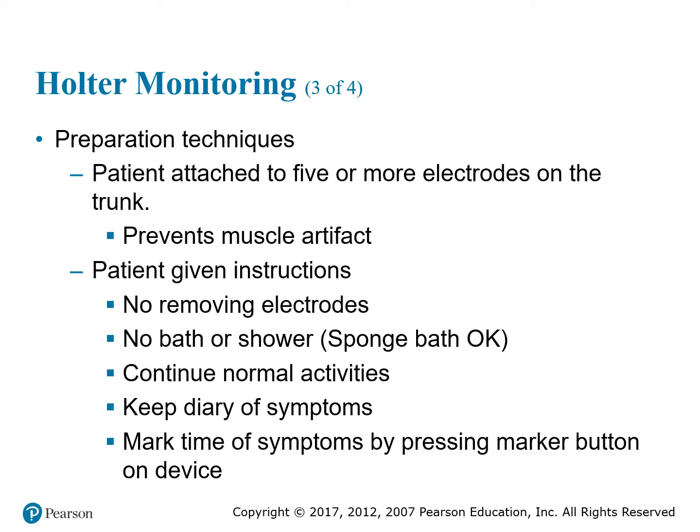Preparation techniques for a patient to prepare for a Holter monitor. Patients must be prepared for the Holter monitoring procedure both emotionally and physically. There's just something about putting a device on a patient to monitor your heart. They sometimes have anxiety. It's our job, as we're placing the monitor or educating the patient as to why we're placing it and what it is used for, to keep them calm and relaxed and not experience any anxiety, which can give the Holter monitor negative readings that they wouldn't normally experience.